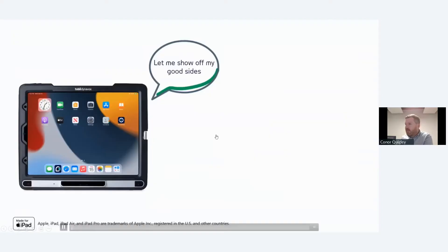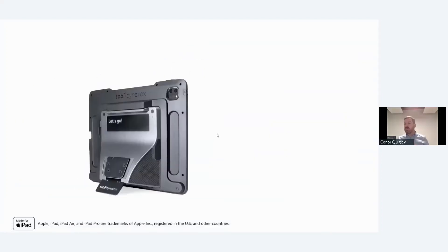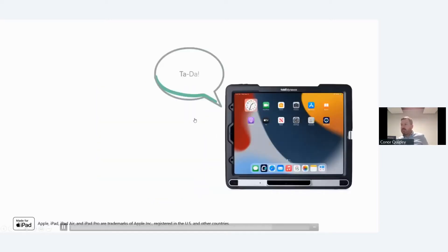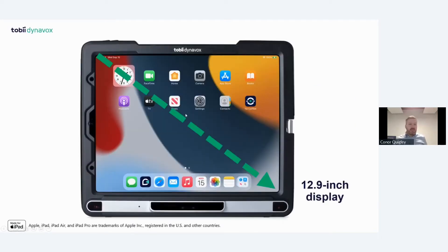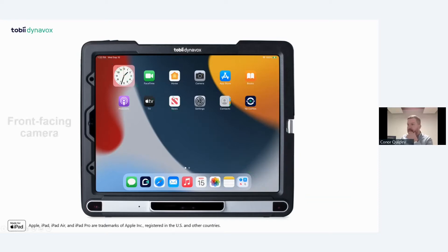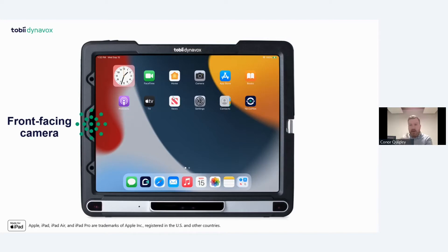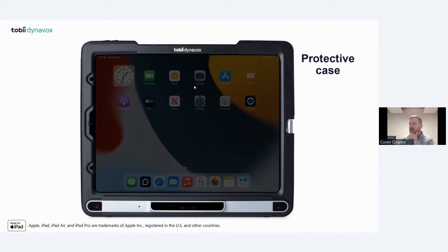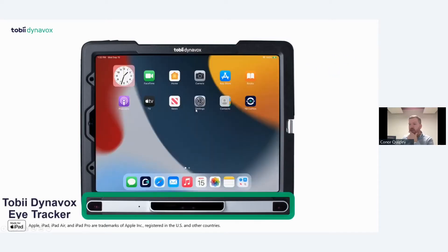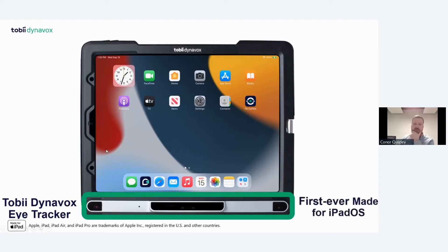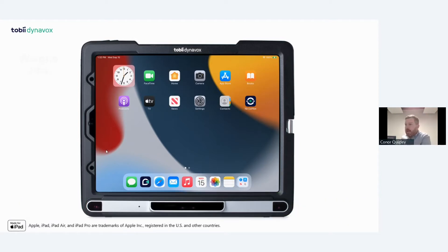Let's go through some of the hardware. The TD Pilot is a 12.9-inch display based on the iPad Pro. It has a front-facing camera for facial recognition, allowing users to independently turn the device on and off, and for FaceTime or selfies. It has a protective case, a built-in eye tracker, and it's the first ever Made for iPad OS eye tracker from Tobii Dynavox. It weighs 2 kg and has up to 10 hours of battery life.